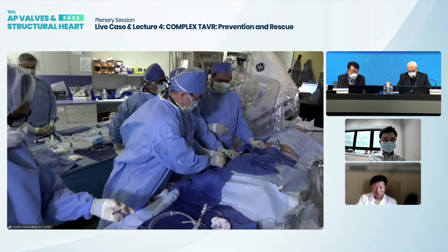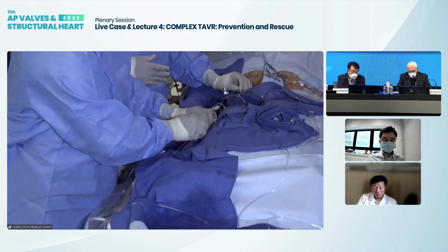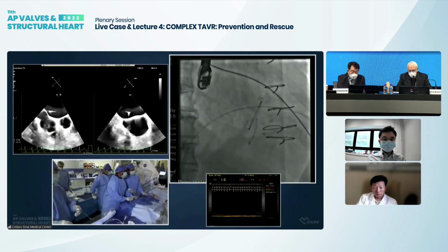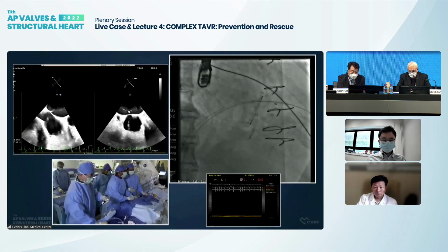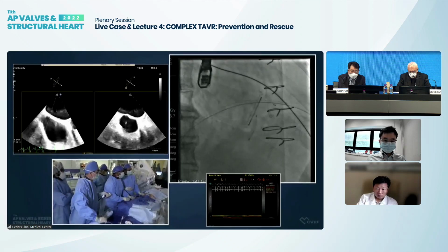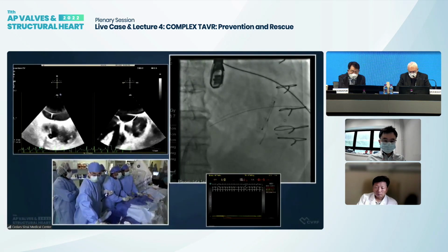So we go between 12 and 14 in terms of dilating the septum. All right, Jubin, go ahead and advance. We will actually use a 14 because this is a live case. We don't want to struggle, and there's not a lot of difference between 12 and 14.